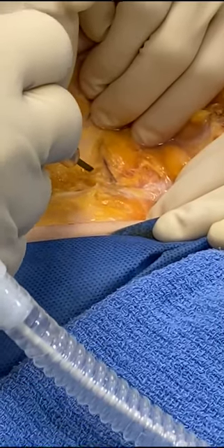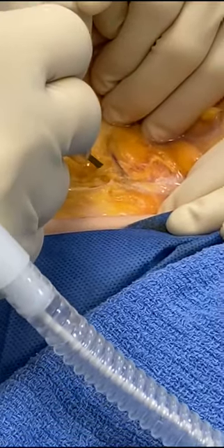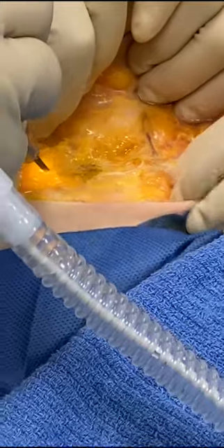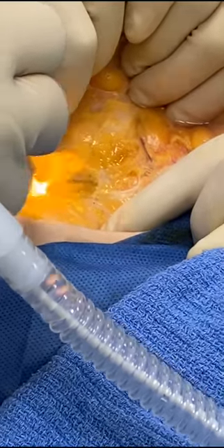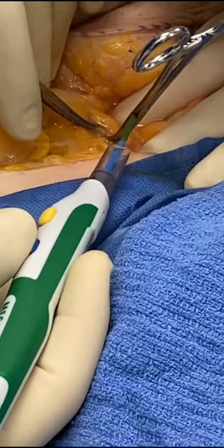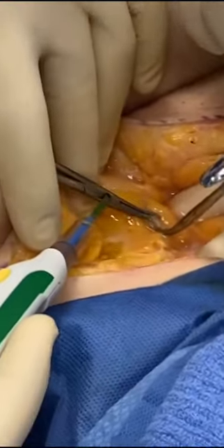That's a big blood vessel there. And look how slow we go. We just take our time and do a completely bloodless dissection here at the Cosmetic Surgical Center of Cerrito. We're gonna clamp that vessel a little later. Thank you. The blood vessel that we're talking about, can you see, Nicholas? Yeah. Close up on that.